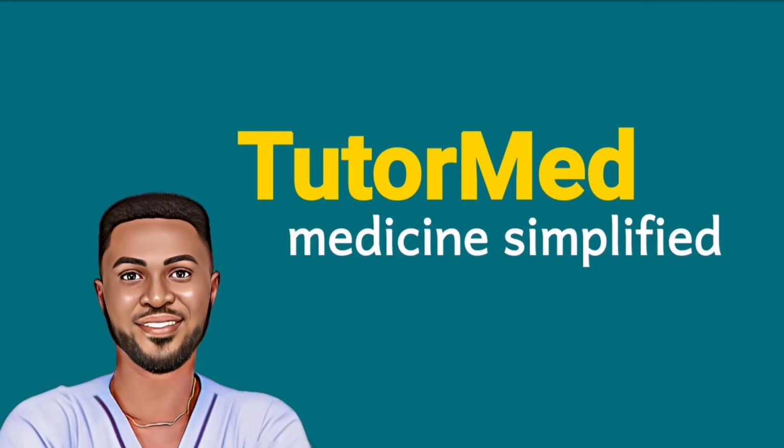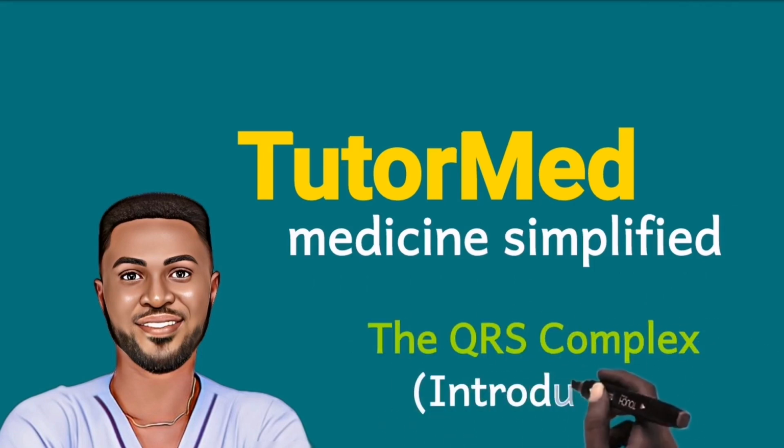We are still on the ECG interpretation, and in this video, we will examine the QRS complex. This will deal with only the introduction, as subsequent videos will treat pathologies like ventricular hypertrophies, bundle branch blocks, etc. And so, we will look at what the QRS complex is, the principles behind its naming, and then some pathologies they represent when they are abnormal.